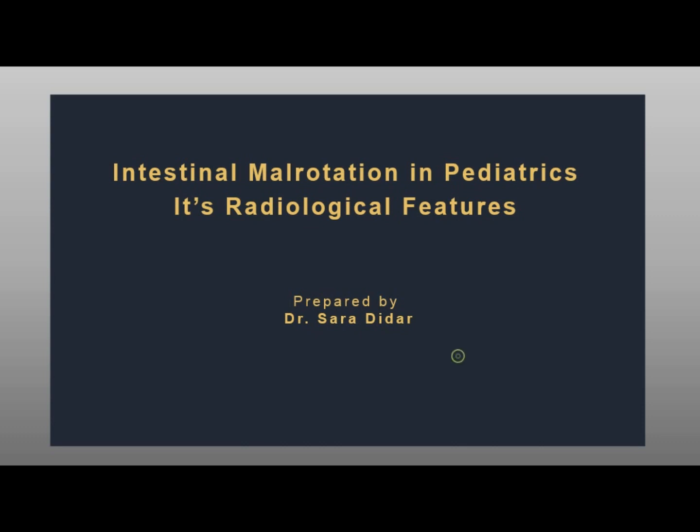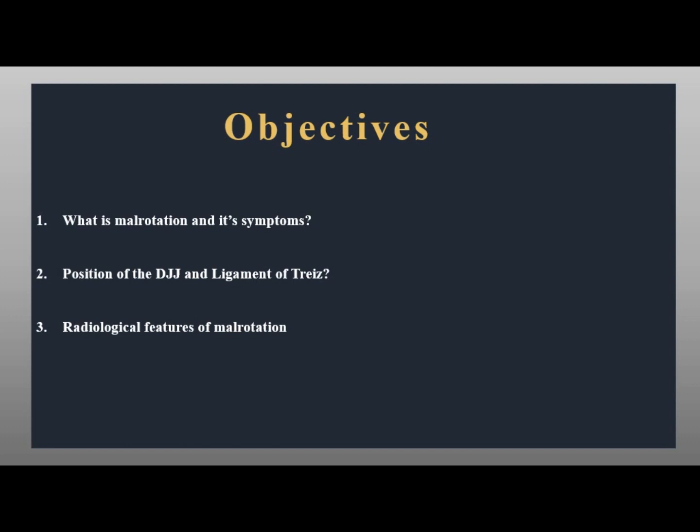Hello everyone. Today I will talk about intestinal malrotation in pediatrics and its radiological features. So we will talk about malrotation and its symptoms, the position of the duodenojejunal junction and the ligament of Treitz, and the radiological features of malrotation.